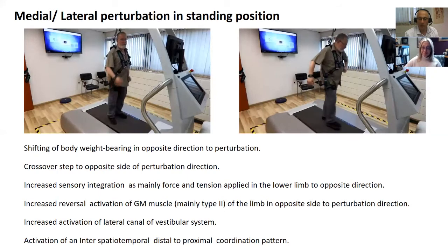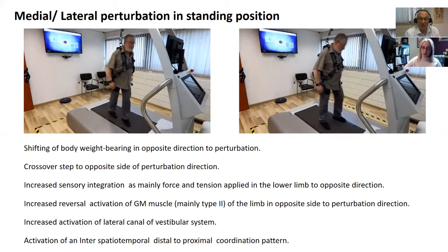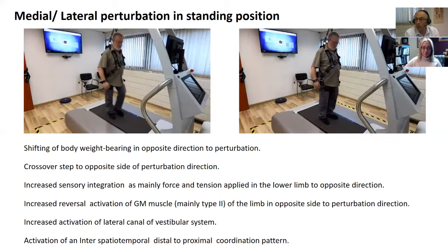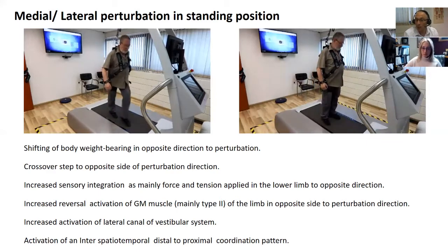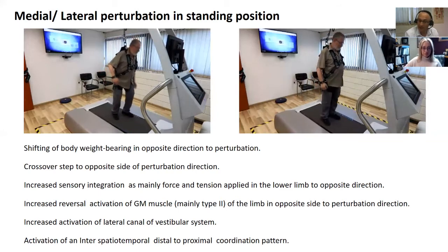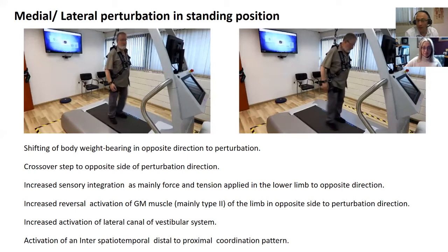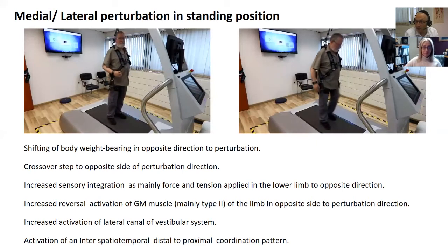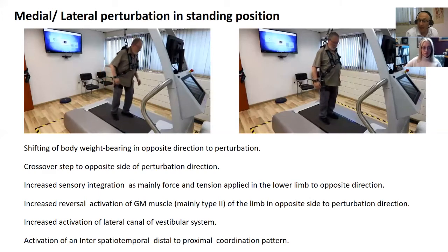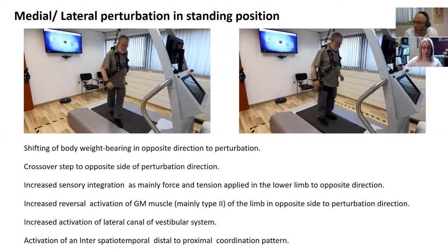Yeah. So we're forcing that weight transfer to the right hand side. And what we can actually see visually is he wouldn't usually do that. He wouldn't train it. He wouldn't be working to that limit at all. But if you force him to do it, because it's the reactive response which is forcing him to do it, then he's practicing that. So we want to increase the amount of time that he has in that right single foot stance phase. So if that's our objective, we saw that while we were looking at the gait analysis, and we see this while we're moving the treadmill, then we can just repeat it over and over again.